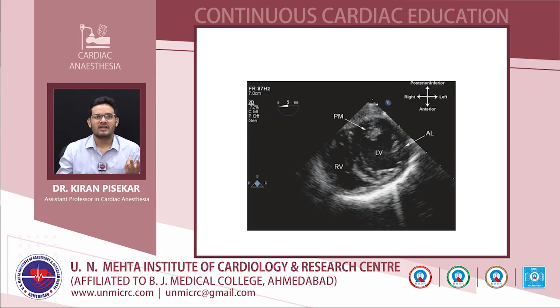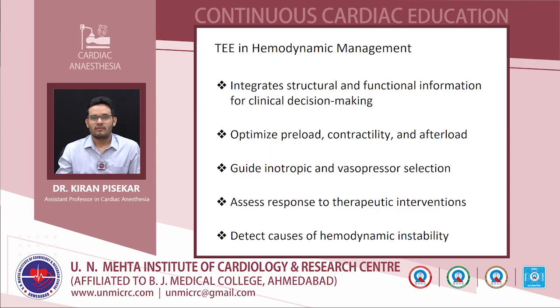We can compare the diastolic and systolic diameter of the LV, which will help in volume assessment, a good measure for goal directed fluid therapy. Also in this view we can put the M mode and measure the ejection fraction.